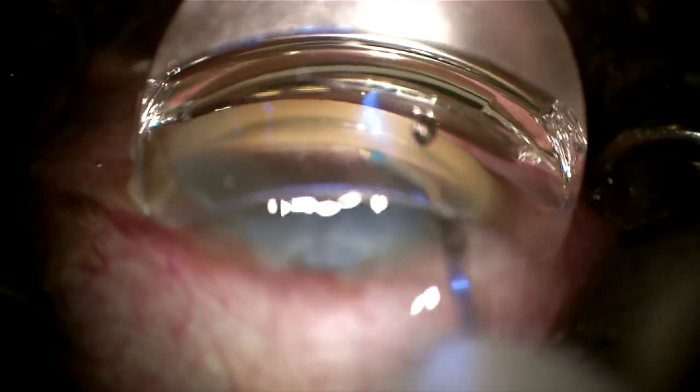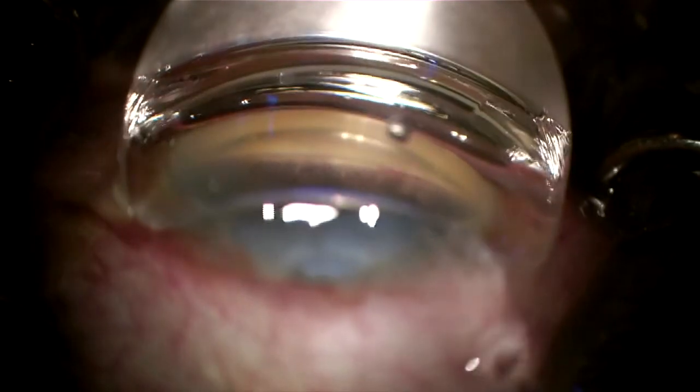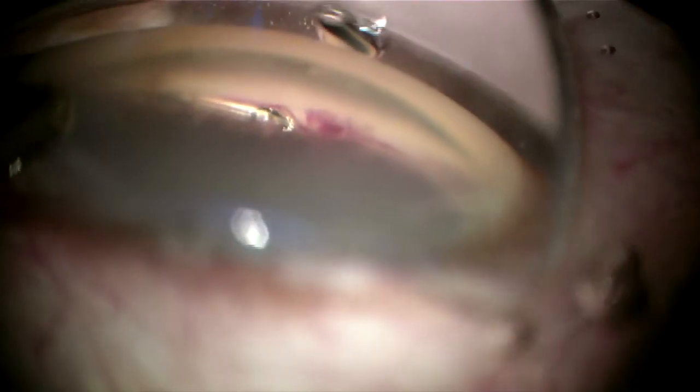Reversing it as I release viscoelastic to flush out Schlemm's canal and the distal channels. Now I'm taking the Hydrus microstent loader, which looks very similar, and advancing the microstent into the same area. It really slips in like butter. Beautiful. And now we see a nice inlet there in the AC.